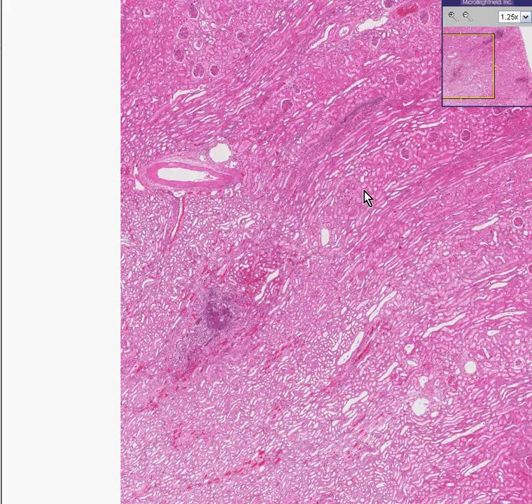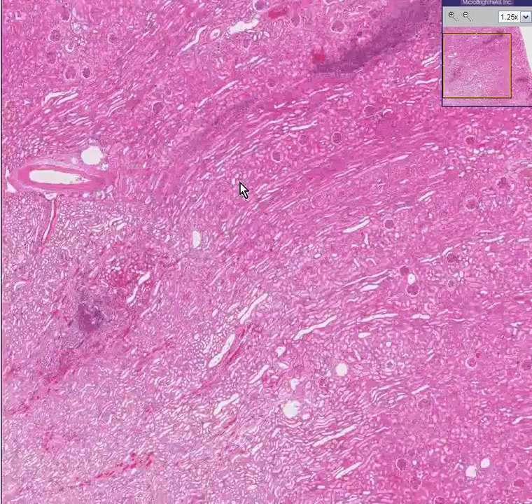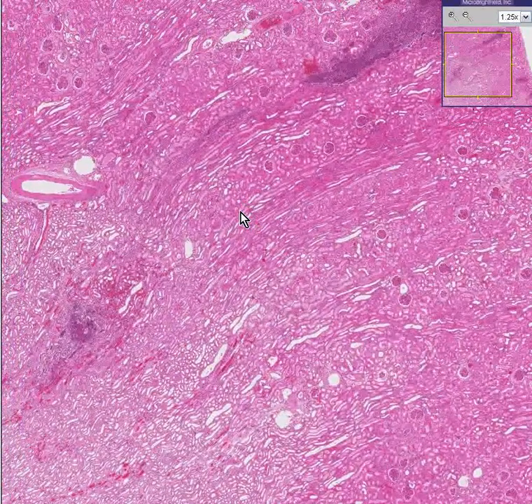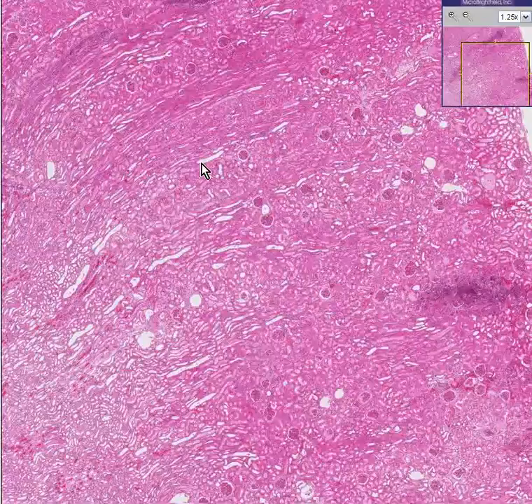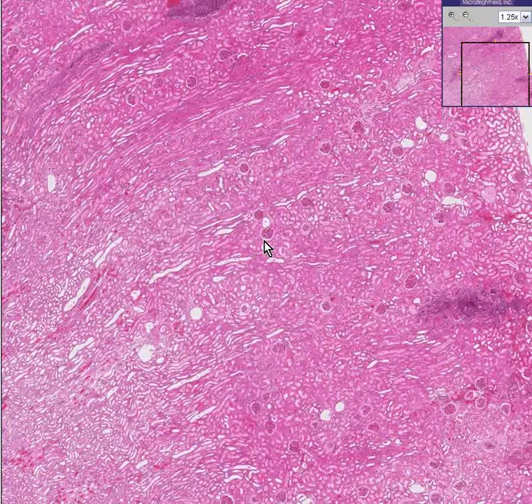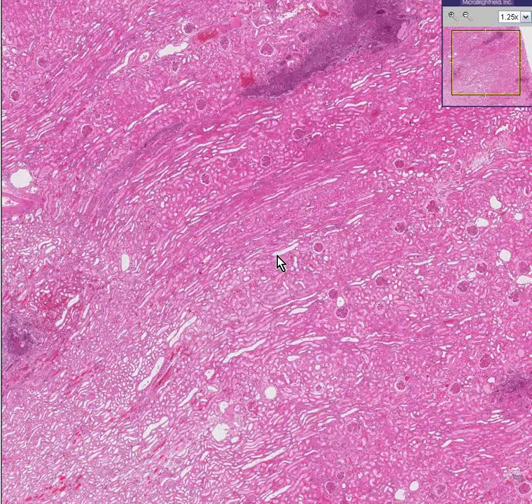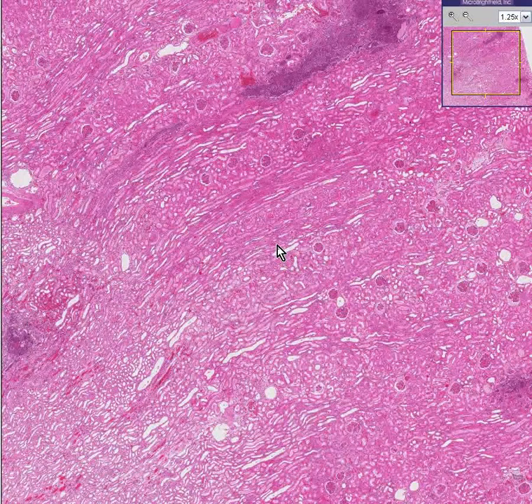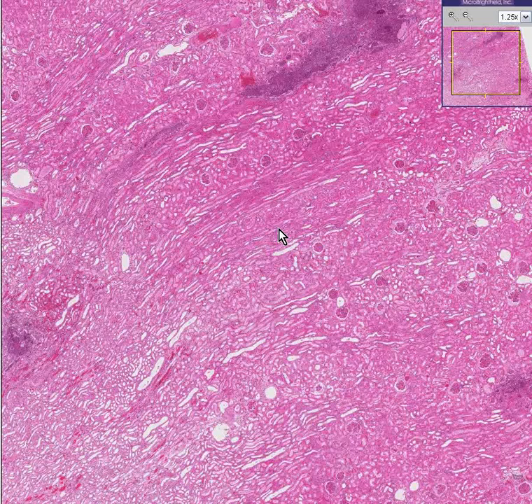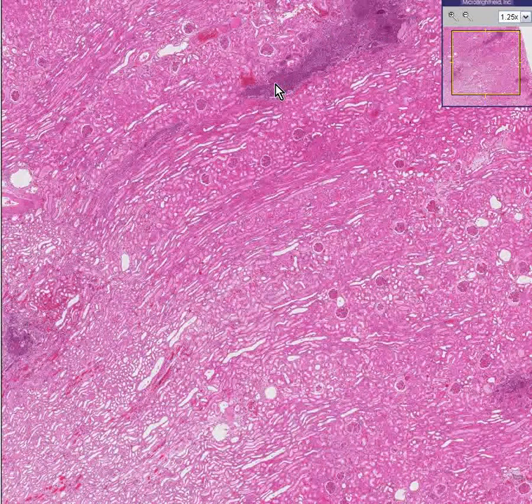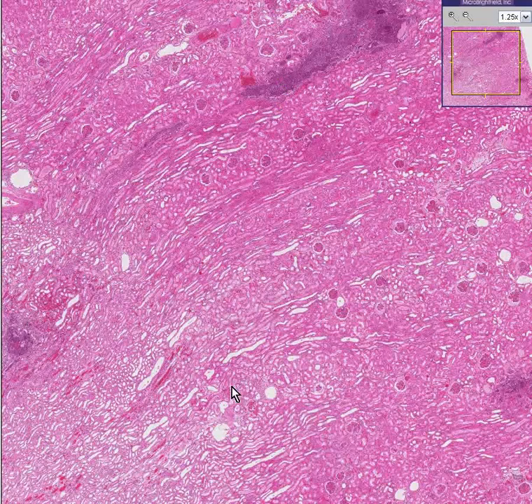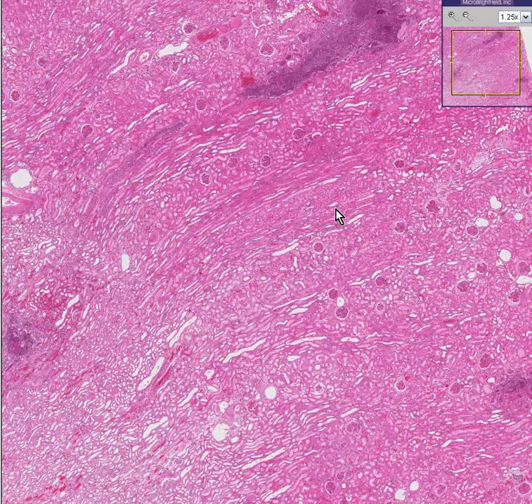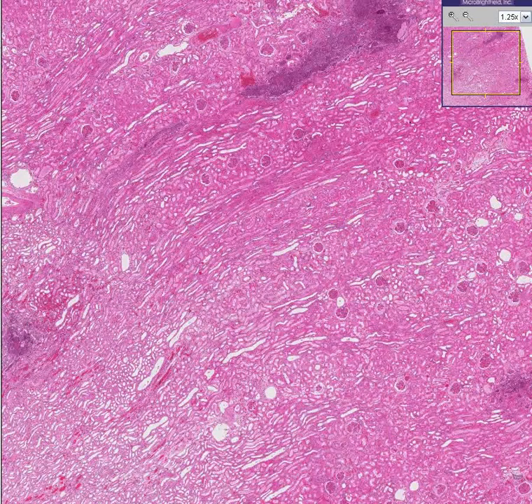This is classical. In fact, from a logical and anatomic point of view, and a knowledge of anatomy, physiology, and now hopefully a little bit of pathology, you see multiple little abscesses within the kidney — think bacterial endocarditis. Think of the organisms that are involved with bacterial endocarditis rather than the ascending gram-negative organisms which might be causing a pyelonephritis. Thank you very much.